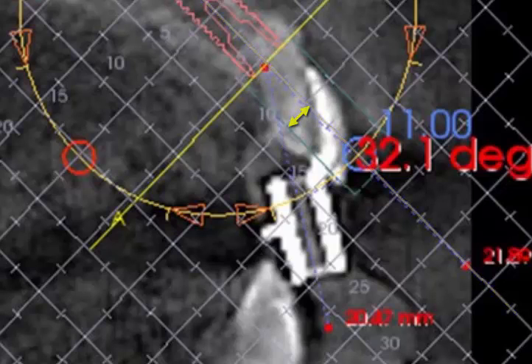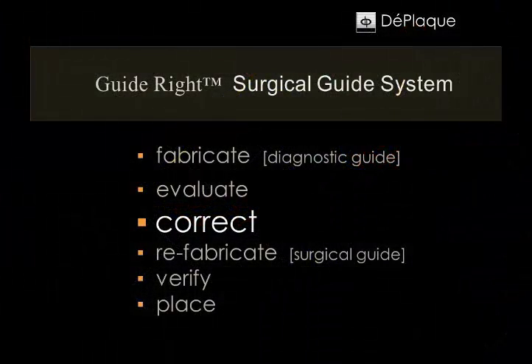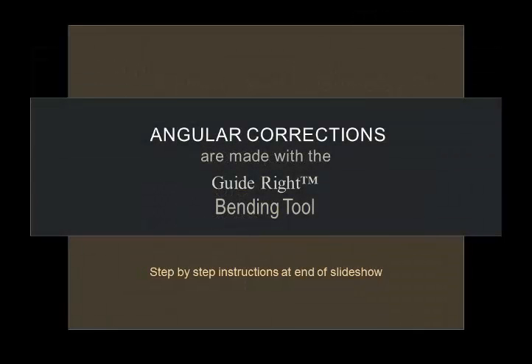The linear offset correction is 2.5 millimeters, 1/2 the length of the grid square. In the in vivo 5 software, each grid square measures 5 by 5 millimeters. A 2.5 millimeter offset guide post is selected and a 32-degree angle correction will be made.